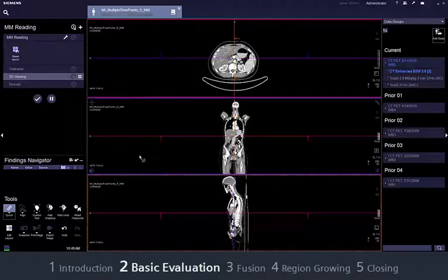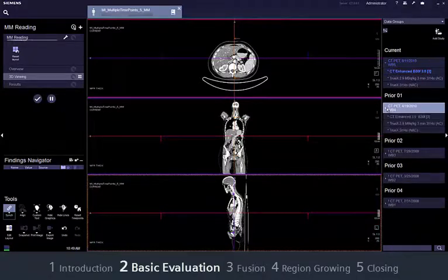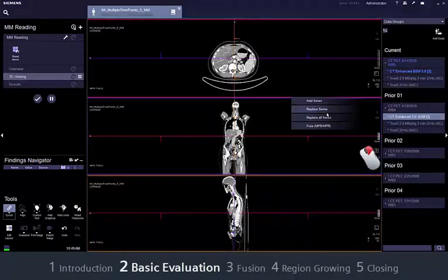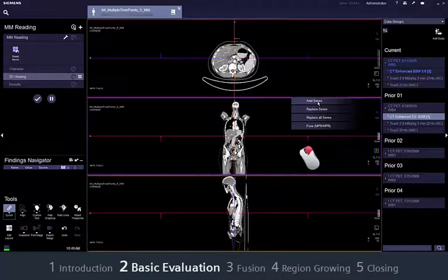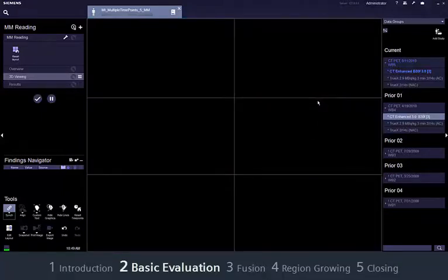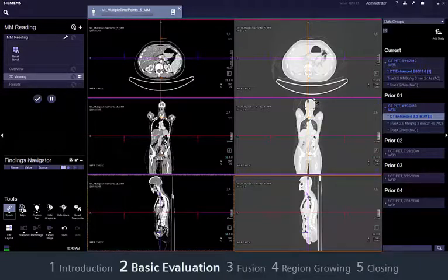In the 3D viewing workflow step, the layout automatically adjusts the number of segments when you drag and drop additional series from the series navigator into the viewer. To transfer the data, right-click the data set you want to add and drag and drop it into the viewing area. Up to four data sets can be loaded side by side and are synchronized automatically.